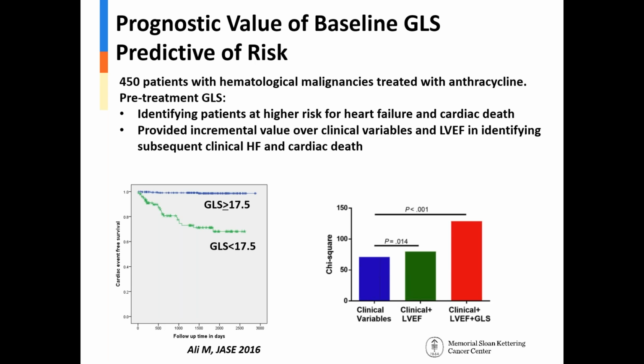This is Dinesh. If I could just add something, I think a point that Vlad brought up is very important. I really want to address this issue about use of GLS affecting cancer therapy. Hearing that kind of concept is a little bothersome, because the whole purpose of using strain is to prevent that exact thing from happening. Preventing interruption of cancer therapy should really be the goal of using more sensitive methods.